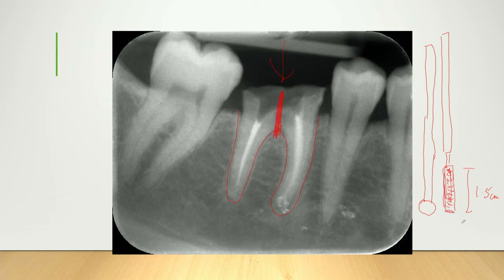That's just personal preference. But if, for example, in this case, you can imagine having that straight round burr just basically whiz around mesial and distal, you'd get rid of all the bone that's holding that tooth in place just from pretty much running your burr, a little bit mesial, a little bit distal, and a little bit interseptal. And you're basically creating room. Once you've done that, you should be able to get those 2 roots out, even with a little bit of a curvature, okay?